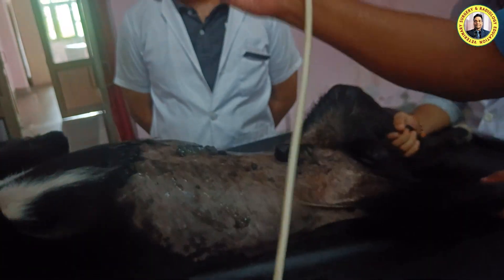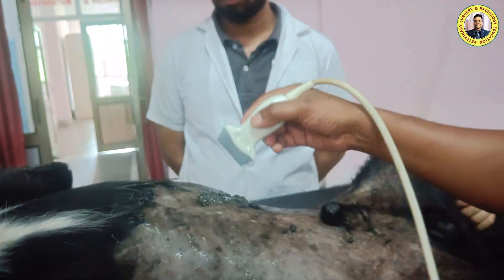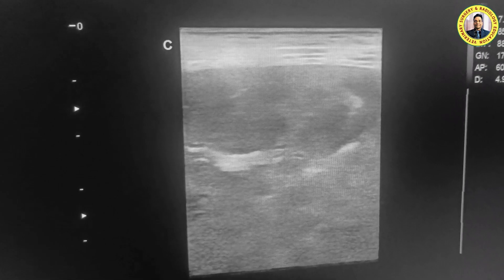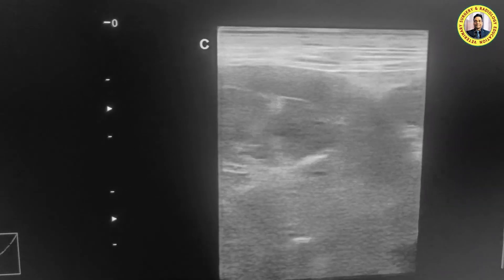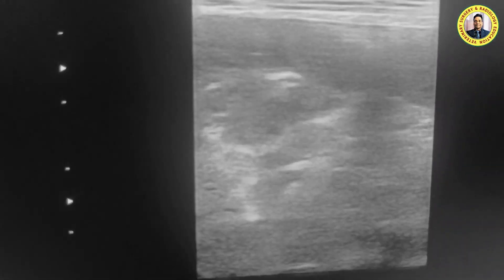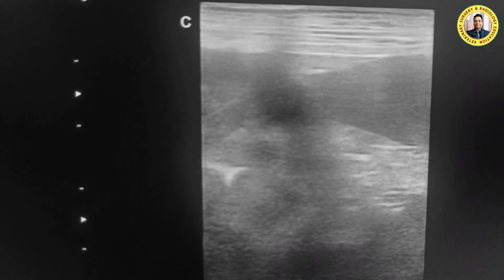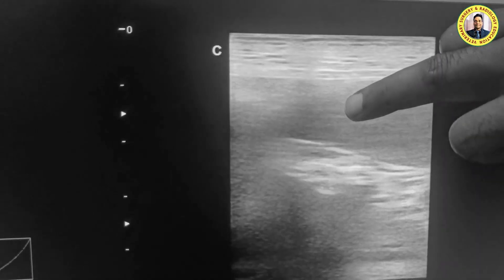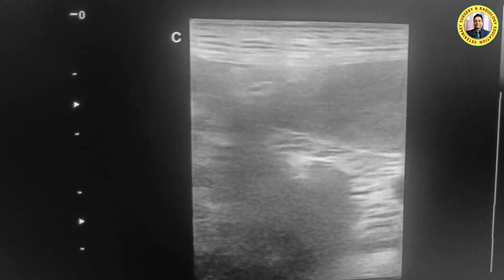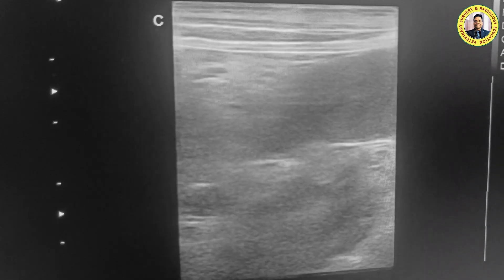Now we have changed to the 7.5 MHz linear transducer. You can see the hard mass much more clearly now. This is a mixture of hyperechoic and hypoechoic soft tissue echogenicity. This is the spleen, and you can see very clearly that this mass is definitely originating from the head of the spleen.